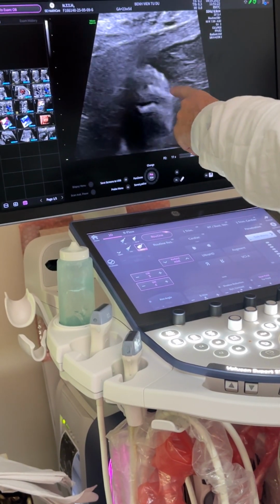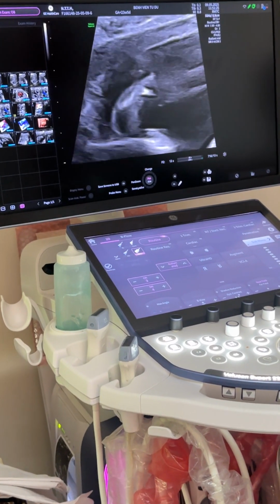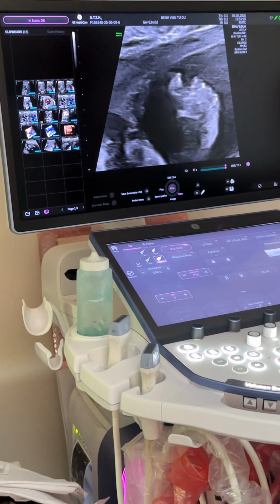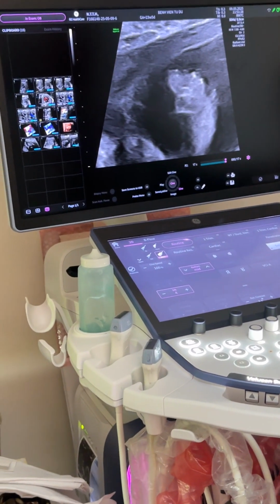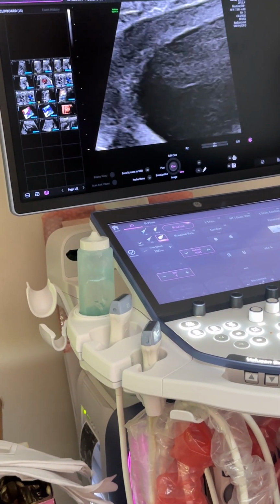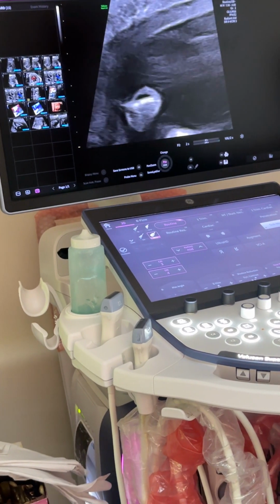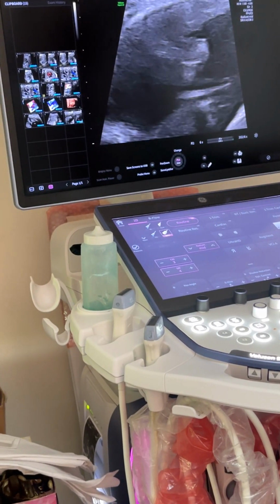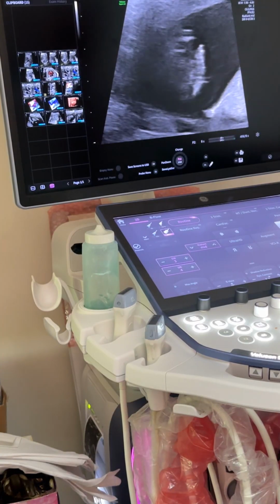I can see fluid between these digits, but the second and third digits of the toe, I just wonder whether they are fused or not. Because you always ask the question, but it's extremely difficult with syndactyly of the feet. But just because I know there's a problem on the hands, I want to check whether there's syndactyly of the baby's toes.